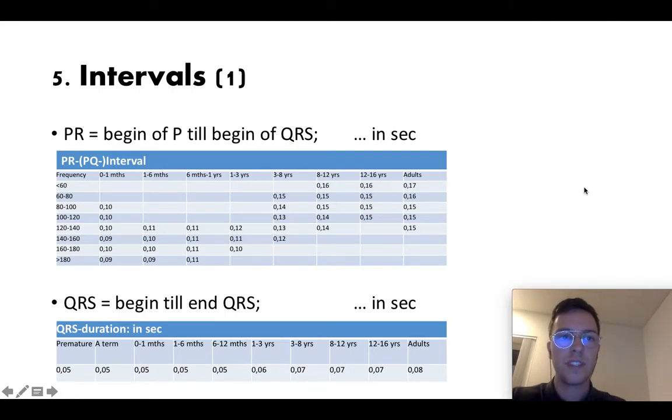So then we look at step five, the intervals. Check what PR is. That's the beginning from P till the beginning of QRS and note that time in seconds, and you can check here if your values are normal values. And here check QRS which is the beginning of QRS till the end of QRS and also note that time in seconds. Here I put the normal values for all ages.